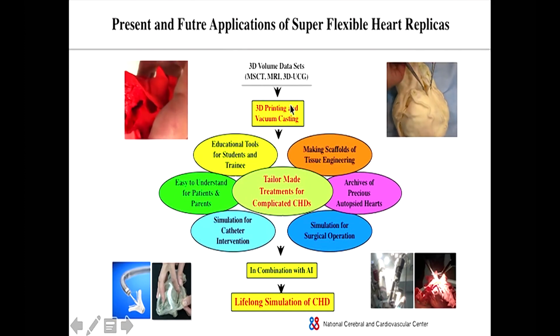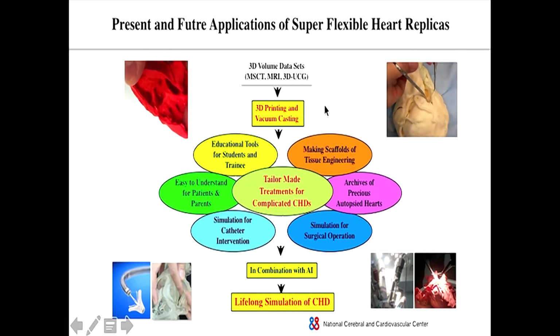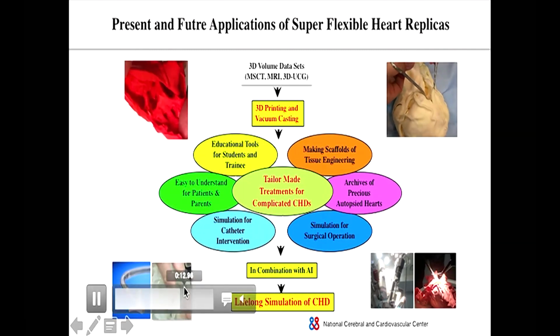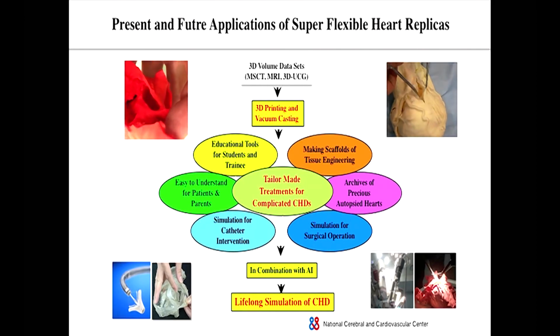do this surgical simulation successfully, and we make the mitral valve model for mitral valve clipping, and we also make the model for Da Vinci robotic surgery and so on. And this equipment will probably be able to contribute to tailor-made treatment for each patient in complicated congenital heart disease.